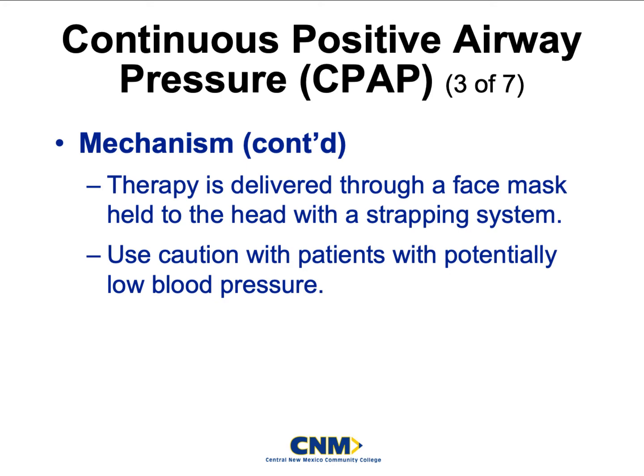If we're doing CPAP and they do have that low blood pressure, we can actually drop their pressure so much that they go unresponsive on us, at which point we can no longer use the CPAP. The patient has to have some kind of respiratory drive themselves in order to use CPAP in the first place.